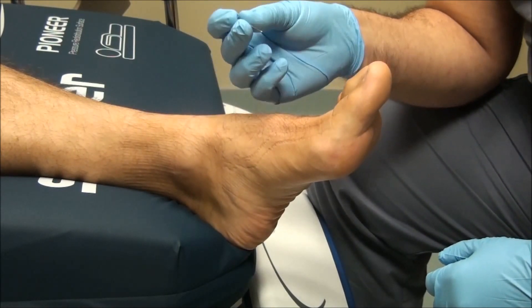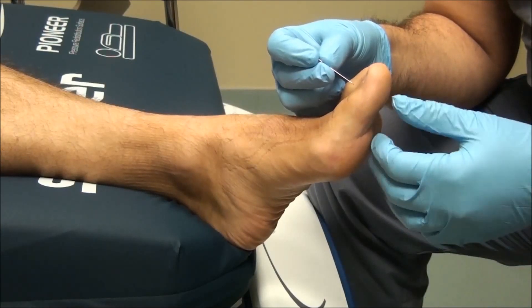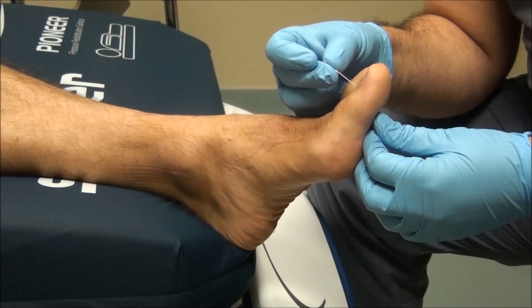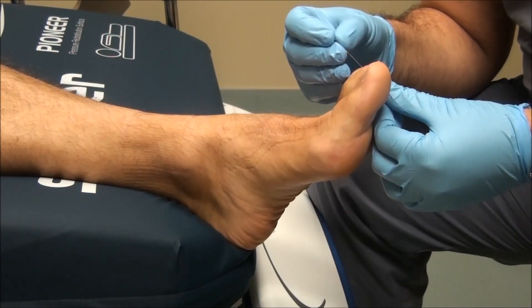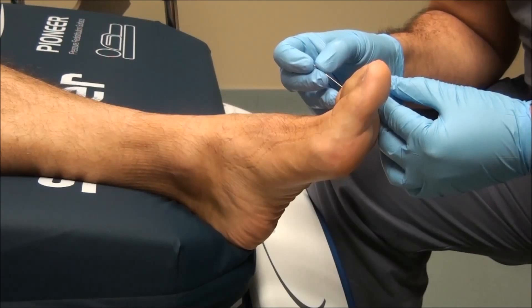You don't want to reuse these. You're going to apply very light pressure to the dorsal surface of the toe just below the nail, just enough to deform the skin but not draw blood. So this will be testing the L4, then you can come to the second or third toe testing L5, and then to the fifth toe testing S1.